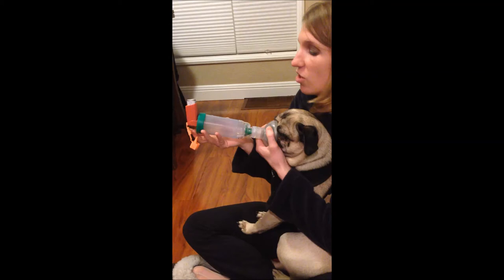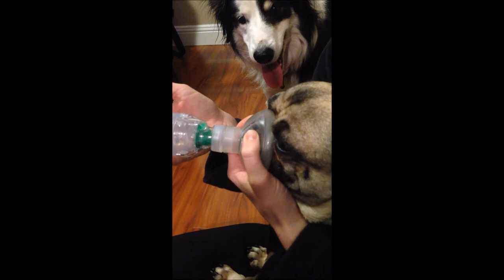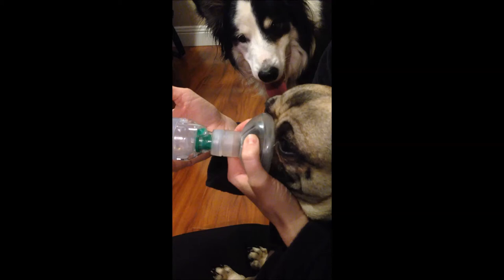You just do one squirt, and then I'm counting the number of times this comes up — so it's just putting the medication in this chamber. And then seven to ten breaths should be sufficient for him to actually inhale it all.